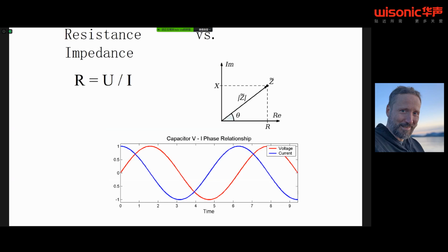A limitation of the studies that I just showed you is that both groups used the square pulse of a nerve stimulator to measure or estimate impedance. However, impedance is a little bit more complicated. It relies on an alternating current, and depending on the frequency that is used, you will obtain different results. Also, impedance, in contrast to resistance, always consists of a pair of numbers. So each measurement with the defined measurement frequency will end up with a pair of measurements giving a complex number. So you will have a magnitude and a phase angle, and these together define the impedance measurement.